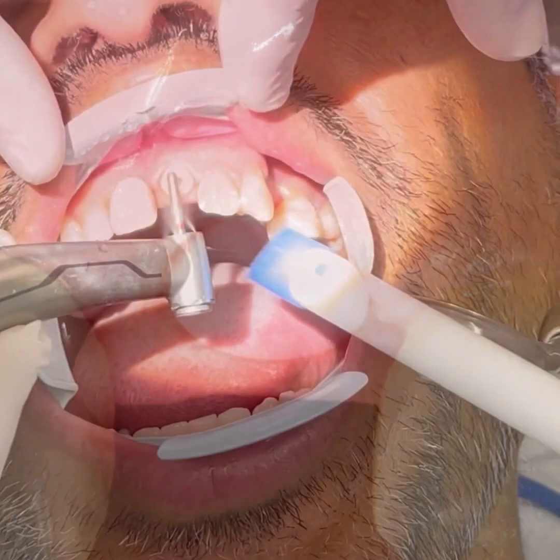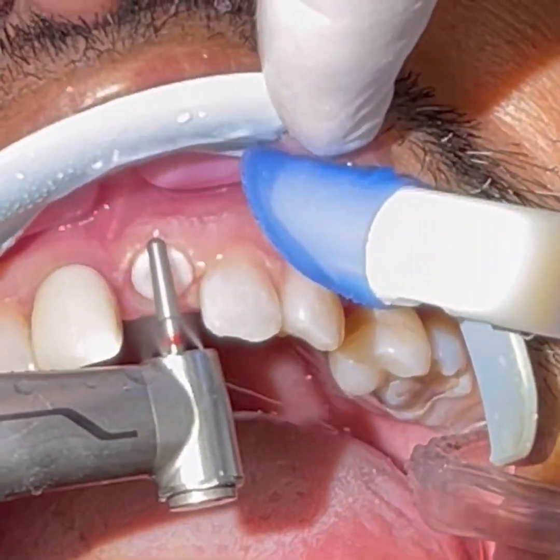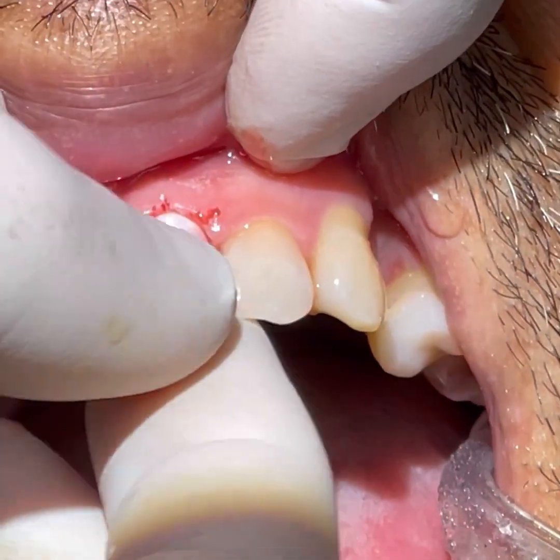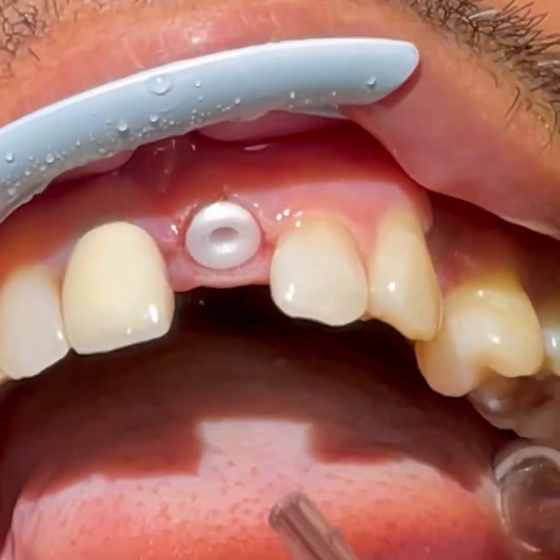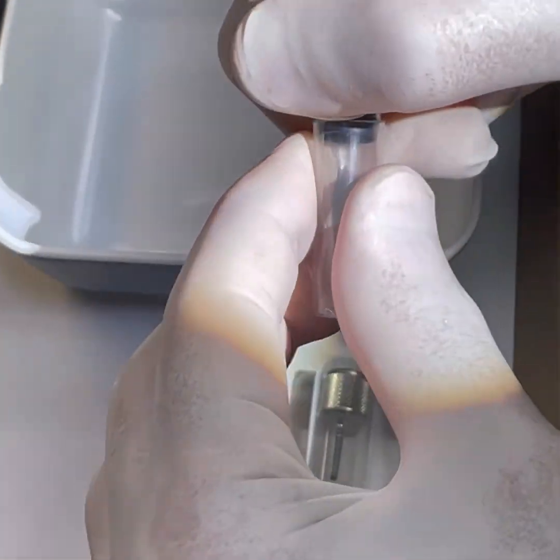The zirconia implant is prepable — the implant margins themselves can be modified with a new red-striped diamond burr. For the choice of abutment we have straight long, straight short, angled long, and angled short, depending on the angulation of the implant. In this case we chose the straight long version.